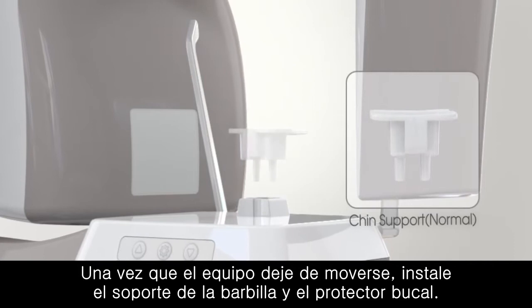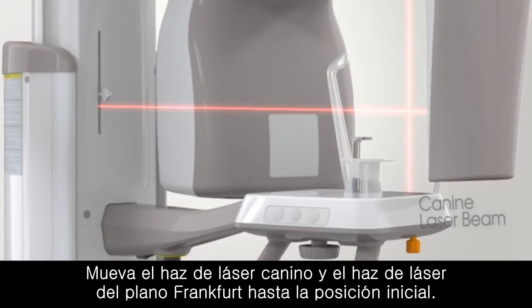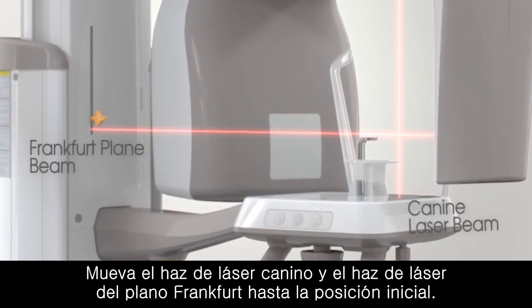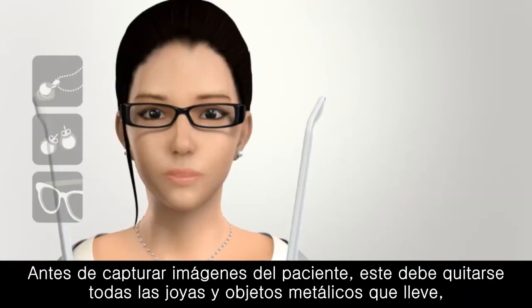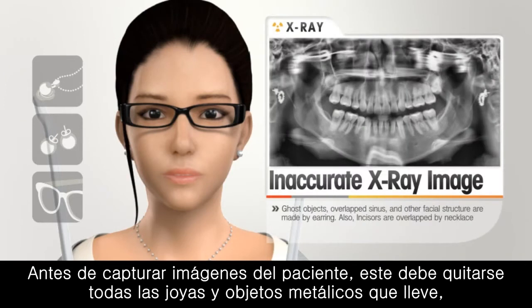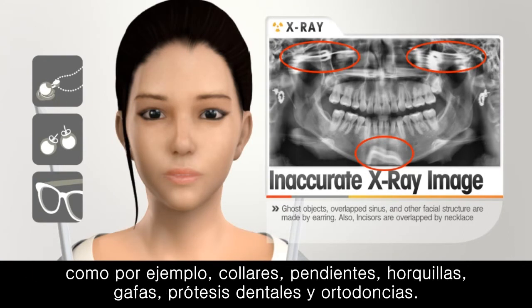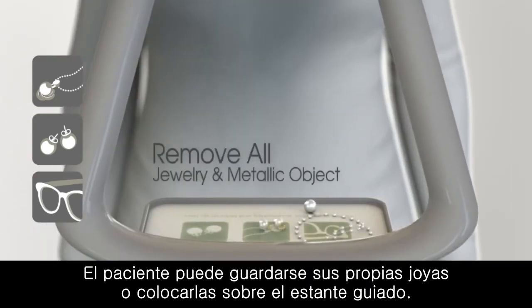After the equipment stops moving, install the chin support and bite block. Move the canine laser beam and the Frankfurt plane laser beam to the initial position. Guide the patient to the unit. All jewelry and metallic objects such as necklaces, earrings, hairpins, eyeglasses, dentures, and orthodontic appliances should be removed before patient image capturing. The patient can keep their removed jewelry personally or place them on the guided shelf.